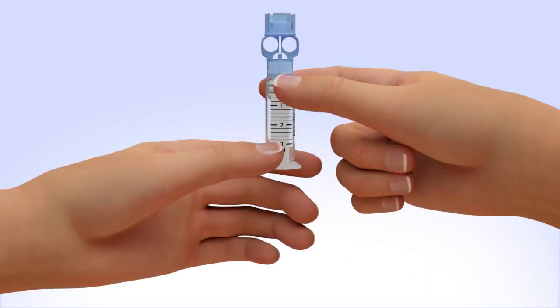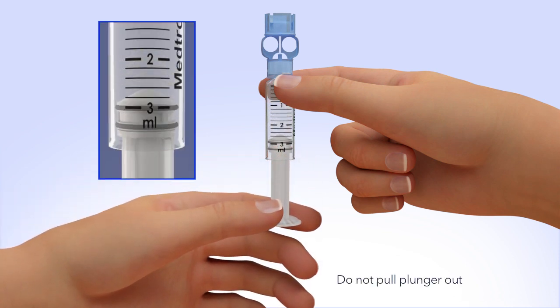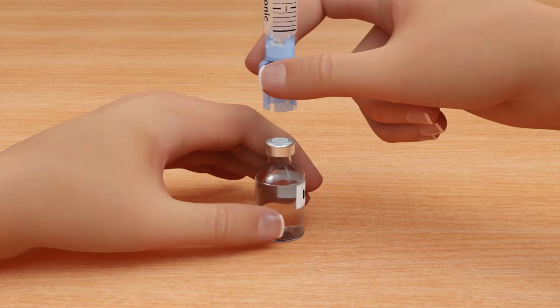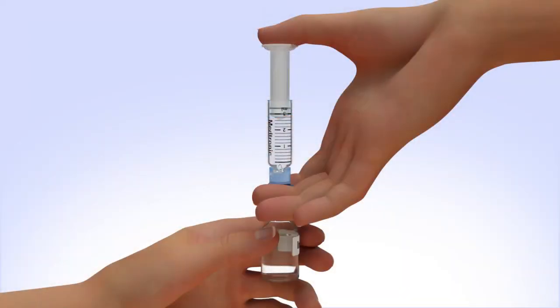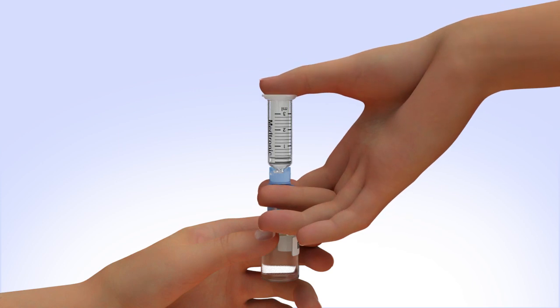Pull the plunger so the top o-ring is positioned at the amount of insulin you plan to put into the reservoir. Be careful not to pull the plunger completely out. Hold the reservoir by the blue transfer guard and connect it to the insulin vial by pressing down. Do not push down on the plunger during this step. Keep the insulin vial upright, place your thumb on the plunger, and firmly push the air from the reservoir into the insulin vial.